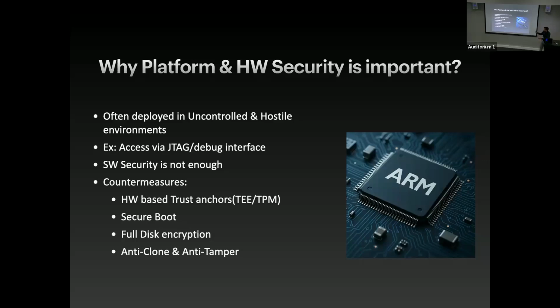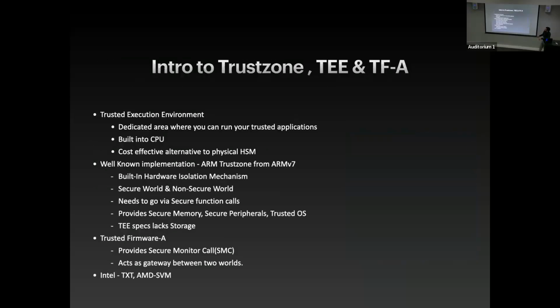So unauthorized code cannot be executed. It also enables you to have full disk encryption, where you can protect all your data at rest, so it can protect against offline attacks. It should also have anti-clone and anti-tamper properties. Some even zero out all the secure storage data if they detect a tampering attempt.